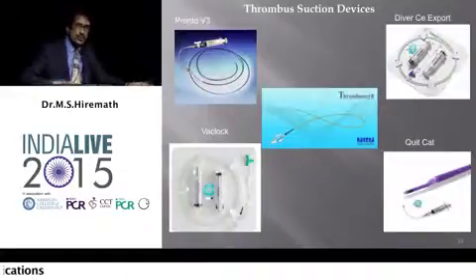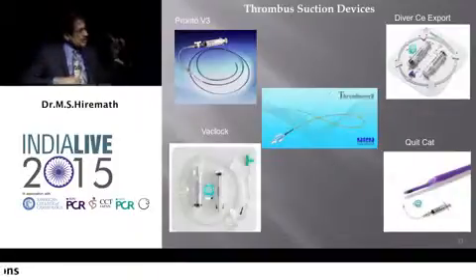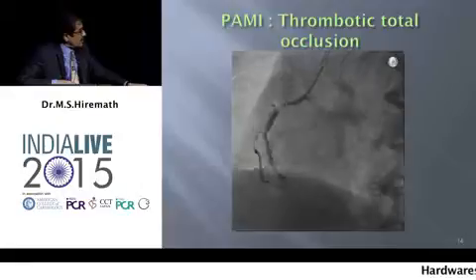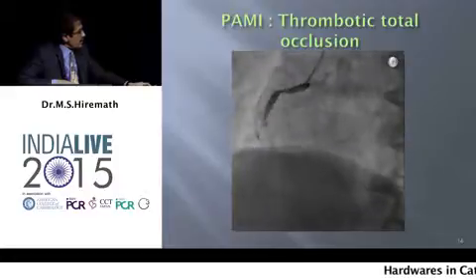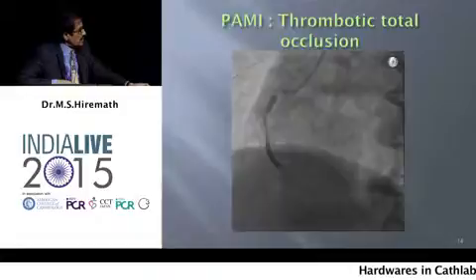Thrombuster 2, good lumen. Most of them have a stillet inside, so you can reach really distality of the coronary circulation, and you can aspirate whatever thrombus is there in this particular site. So this was thrombolized MI on day 2, day 3. And we actually do everything, aspirate, give intracoronary, all the masala that you heard about.